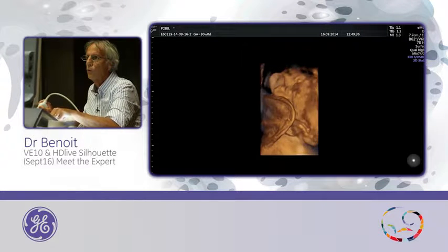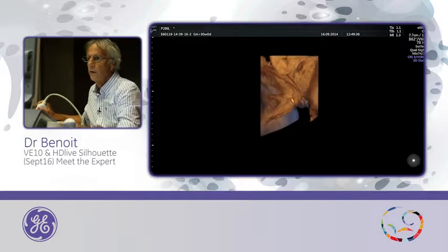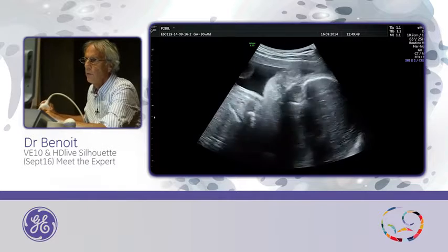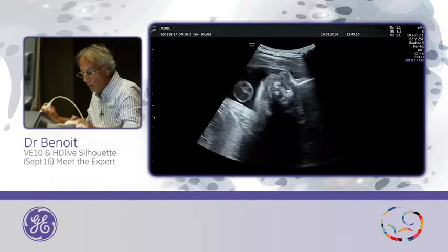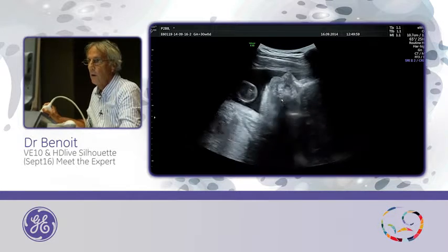I just have to rotate. And this is one ear. And I will show you how to use a new HD Live. So now the baby is not in the perfect condition for the 3D, for the face. Why? Because we don't have too much fluid in front of the face.